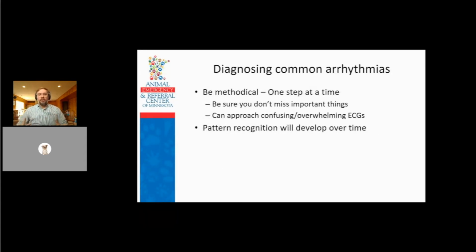So when I approach an EKG, it's important to be methodical and take it one step at a time. One, that prevents you from missing things, and two, it can help you come into a really overwhelming, confusing EKG. I still go through these questions in my head that we're about to talk about next.